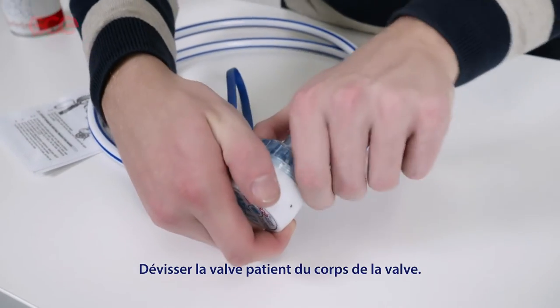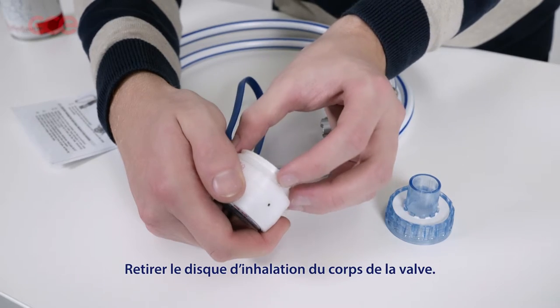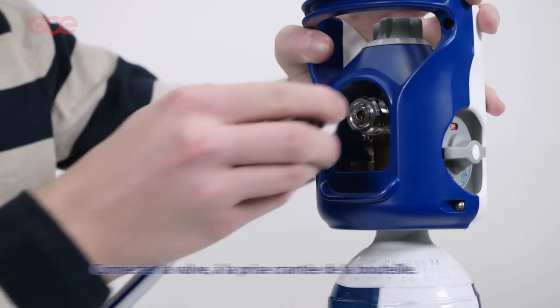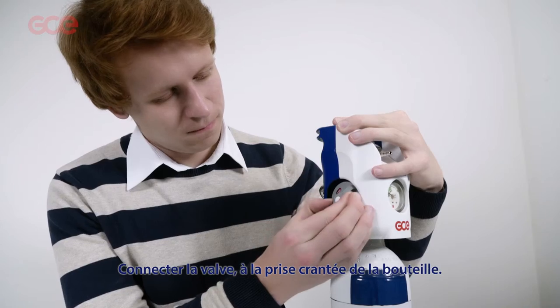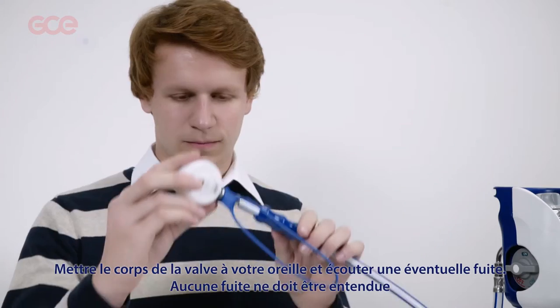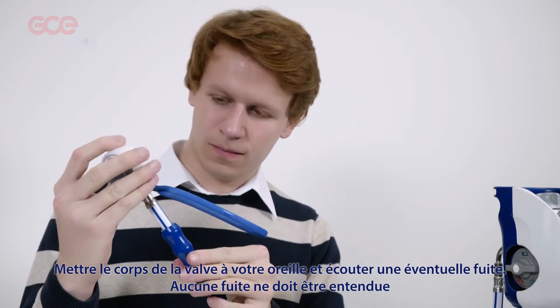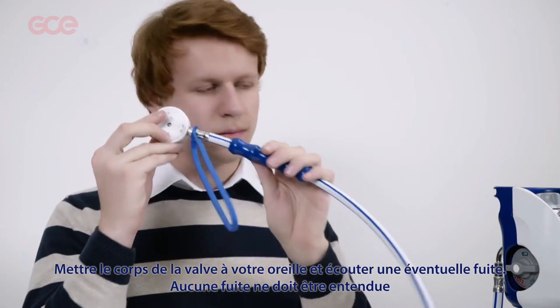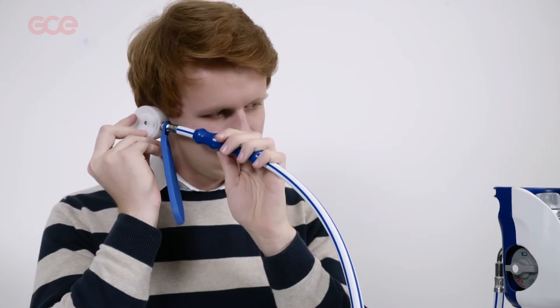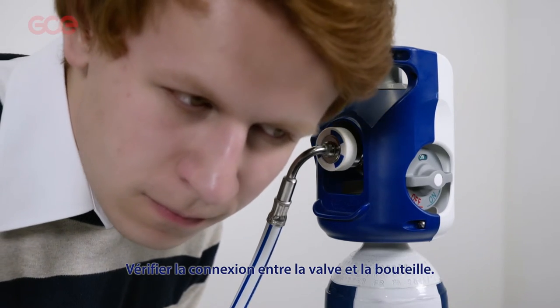Unscrew the patient port assembly from the demand valve body and lift out the inhale disc assembly. While the demand valve is connected to the gas supply, hold the valve body close to your ear with the outlet holes towards your ear and listen for leaks. No leaks should be heard. Also check the connection between the demand valve and the bottle.